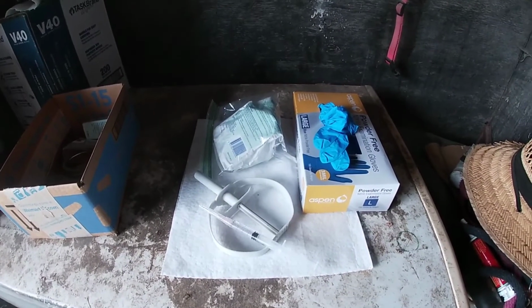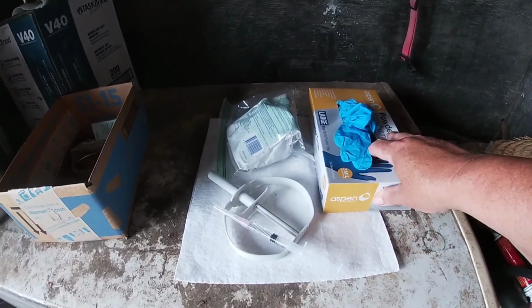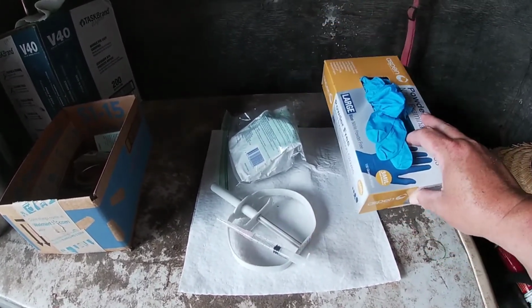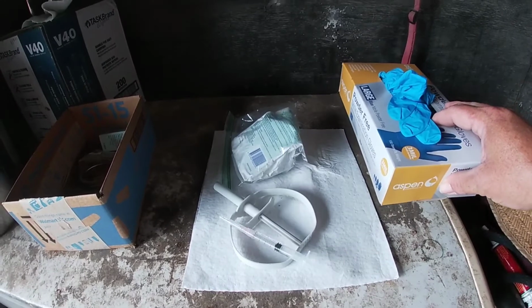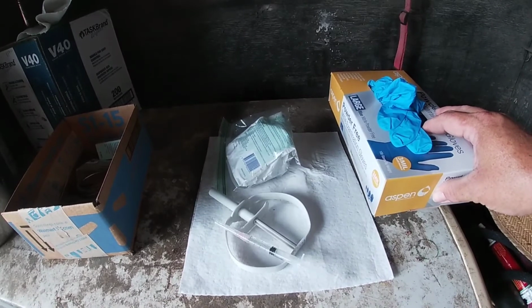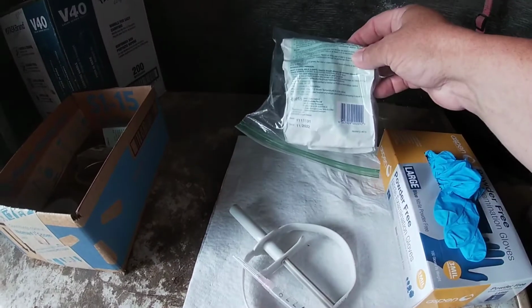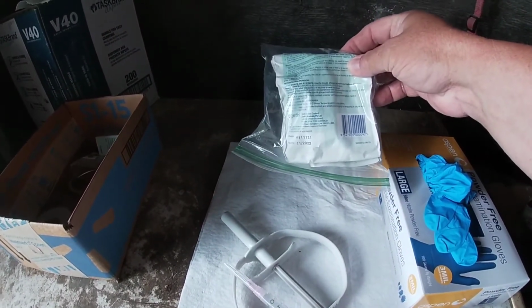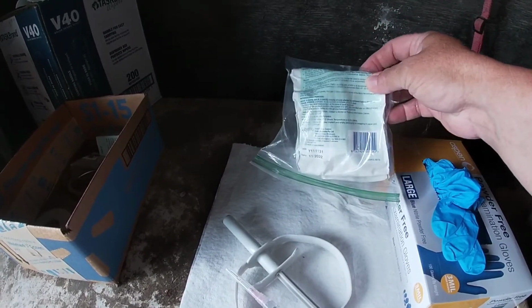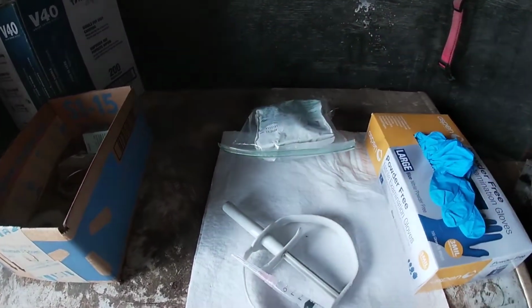So what you will need for this particular procedure is gloves, if you just don't want to get the extra hormones on your hands. You do need to wear gloves, because if you don't, it can affect you, especially if you're of that age where you can have children still. So just be smart, wear gloves. You'll need CIDRs. I keep my CIDRs in the refrigerator. I believe you can keep them in the freezer too, or just somewhere cool. But these are not expired until next year.